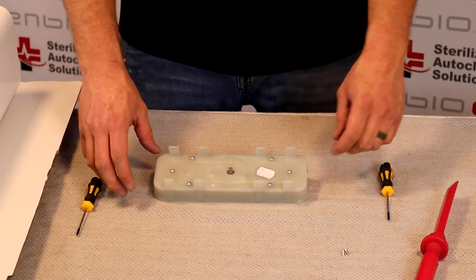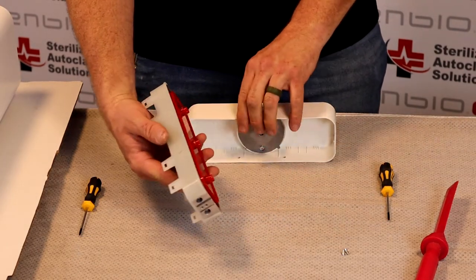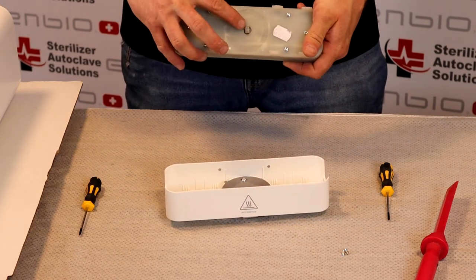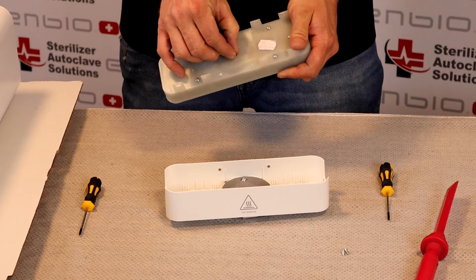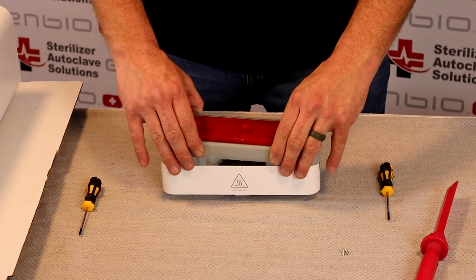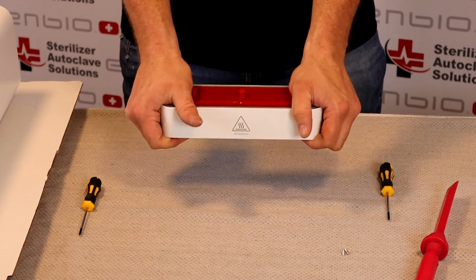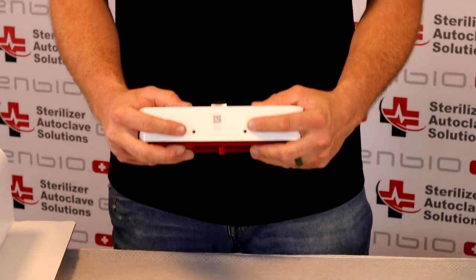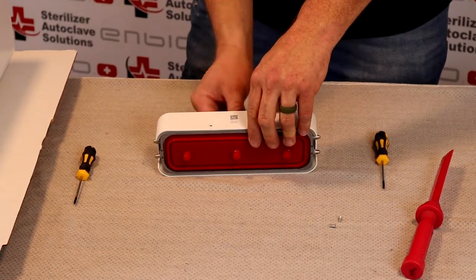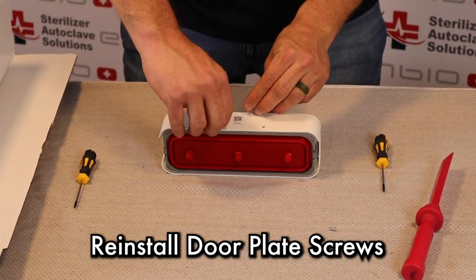After installing those six screws, we are going to install this back into the door plate. You have your bottom holes which are lined up. You want to ensure that this pin is lined up with the pin on the inside. This will just snap and pop back into place and the bottom holes should be lining up. After making sure that your door pins are still coming out, we are going to install the two bottom screws once again.